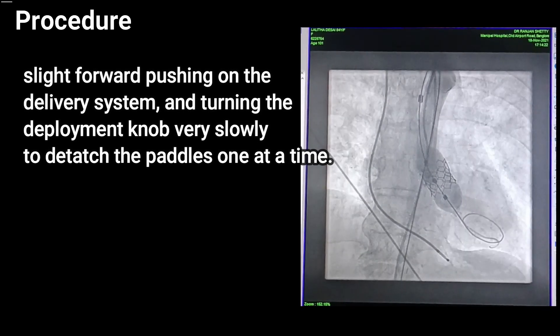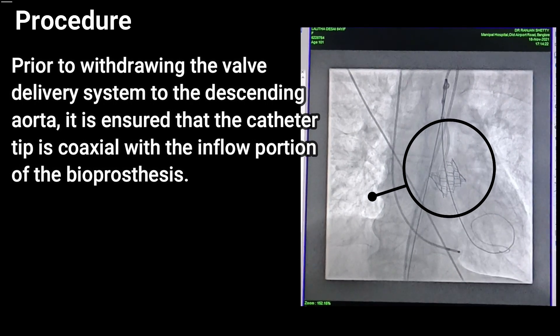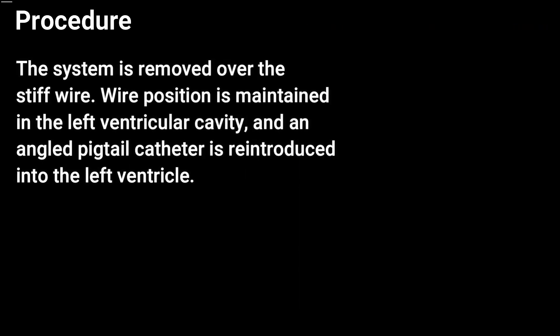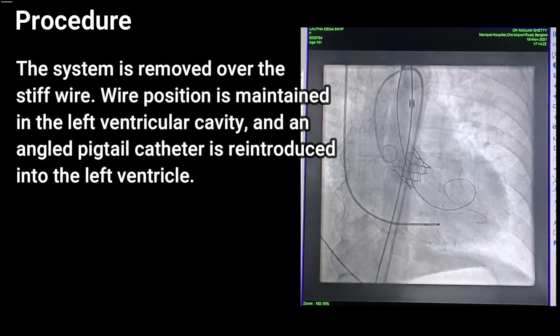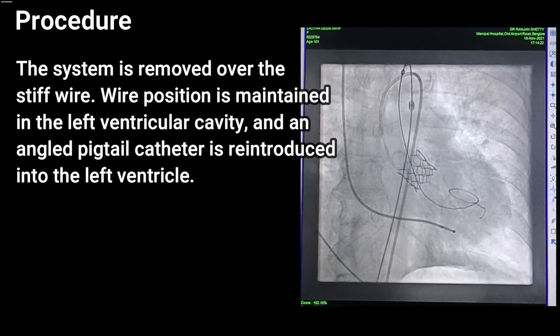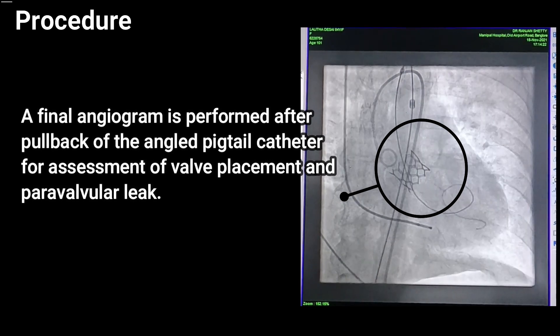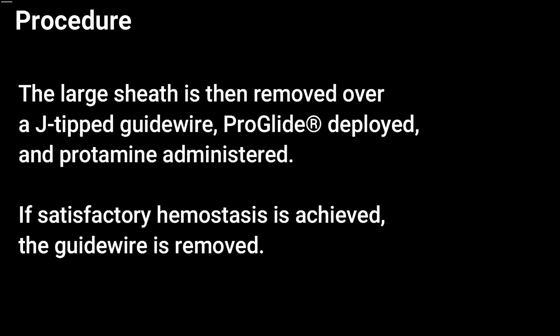Prior to withdrawing the valve delivery system to the descending aorta, it is ensured that the catheter tip is coaxial with the inflow portion of the bioprosthesis. The system is removed over the stiff wire, wire position is maintained in the left ventricular cavity, and an angled pigtail catheter is reintroduced into the left ventricle. The final angiogram is performed after pullback of the angled pigtail catheter for assessment of valve placement and perivalvular leak.